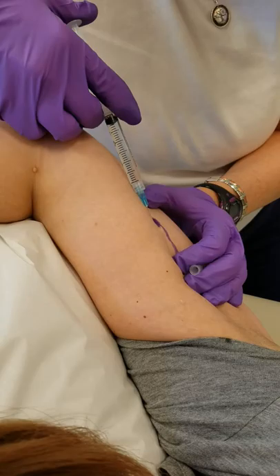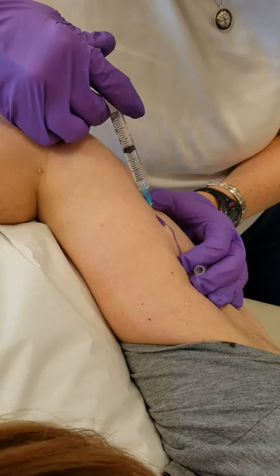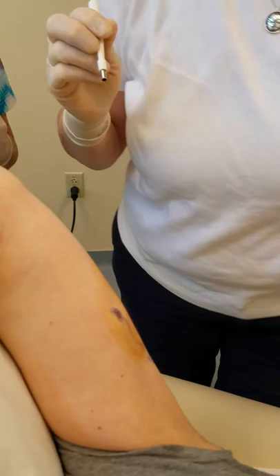This will sting. You want to make sure you put that underneath the Nexplanon rod, or it will tend to push it down. So far it's the same as what I anticipate most people are doing in terms of this procedure.